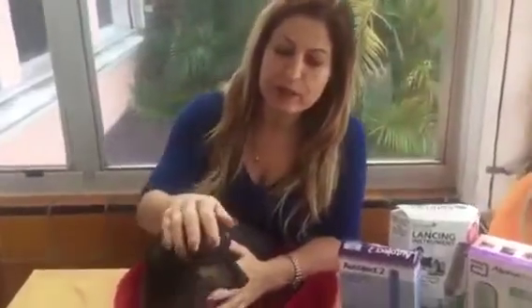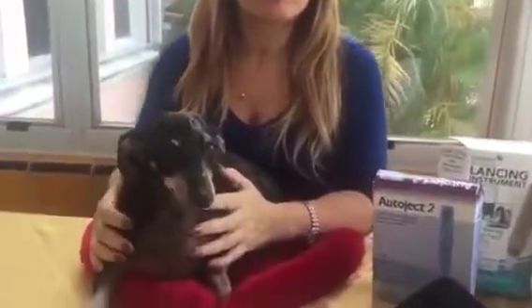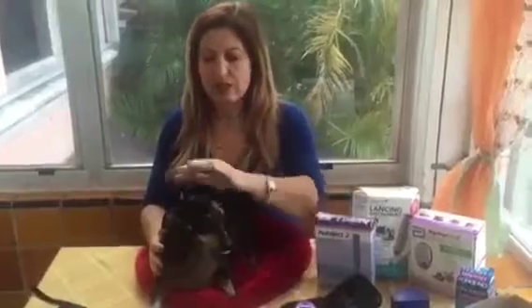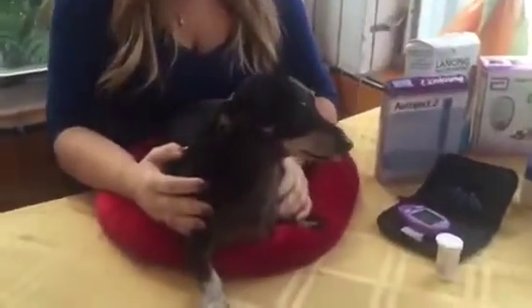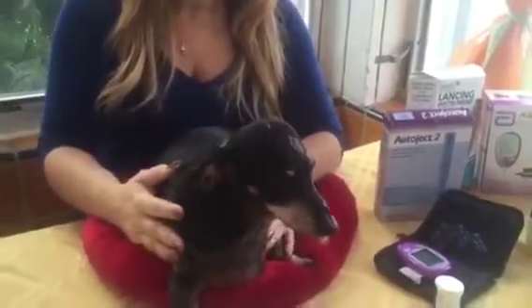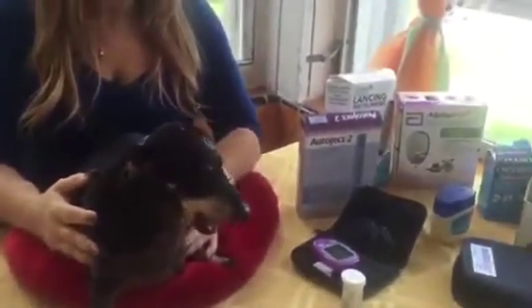Hi everybody, my name is Eliana and this is Marcelo. He was diagnosed with diabetes a few months ago and it is now part of our daily routine to get him tested, his blood gets tested, and also the daily insulin shots. Today I'm going to show you what we do to test his blood and also to get him his insulin shots.